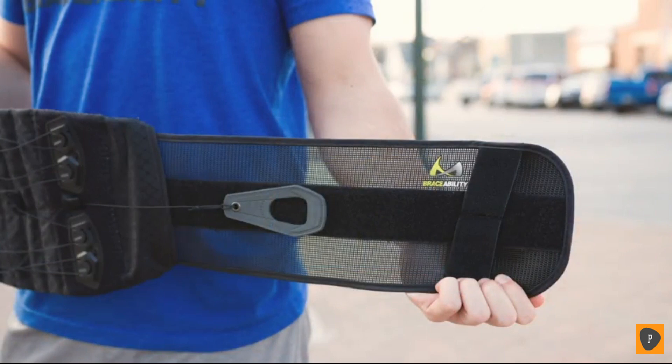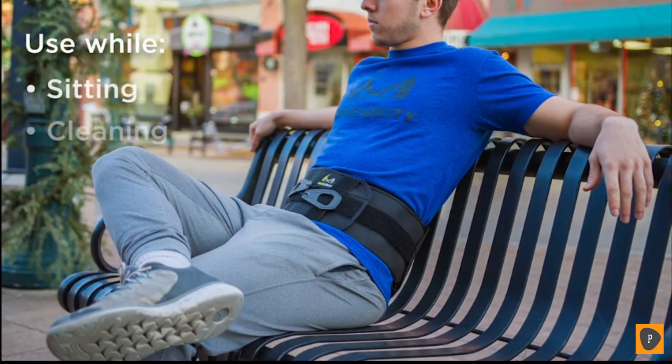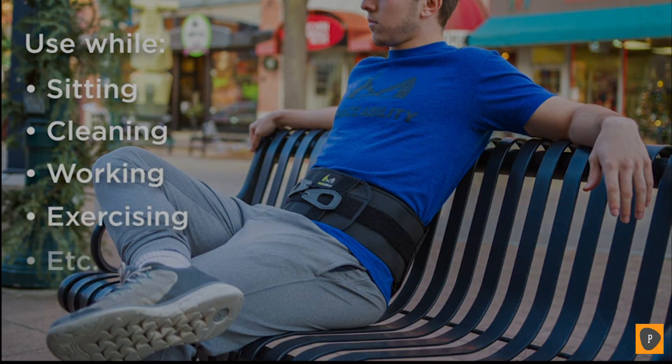This brace's low profile design also incorporates a high tech mesh fabric that helps manage heat and moisture for all day comfort while sitting, cleaning, working, exercising and so on.